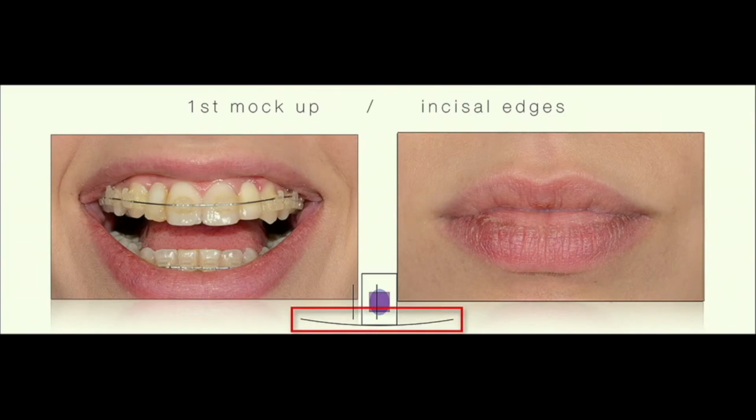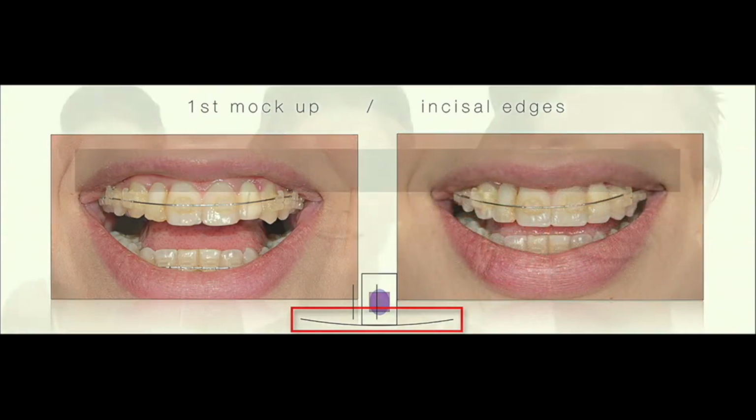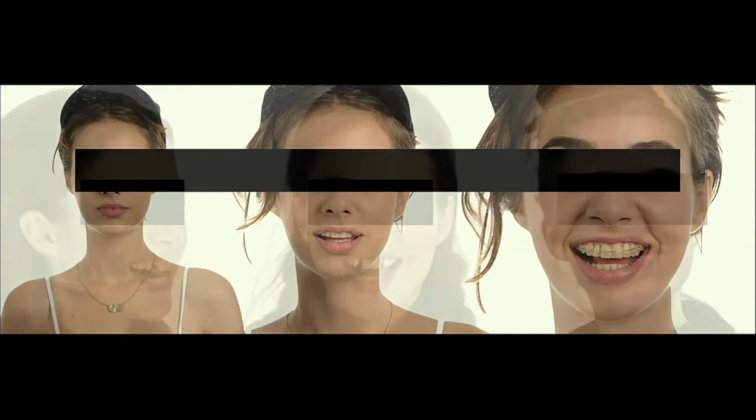And through that, I will take my flowable and just try to set the incisal edge silhouette, the zone, and the length of my centrals. So it looks great. The patient loves it at lips at repose. But of course, at this stage, the more she smiles, it doesn't look that pleasant.